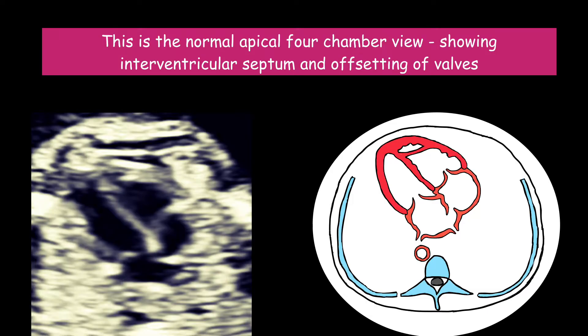This is the normal apical four-chamber view showing the interventricular septum and the offsetting of the valves. In my opinion, it is mandatory to see the heart in the apical view before completing a fetal cardiac examination. This is based on my experience in fetal medicine for over 10 years.